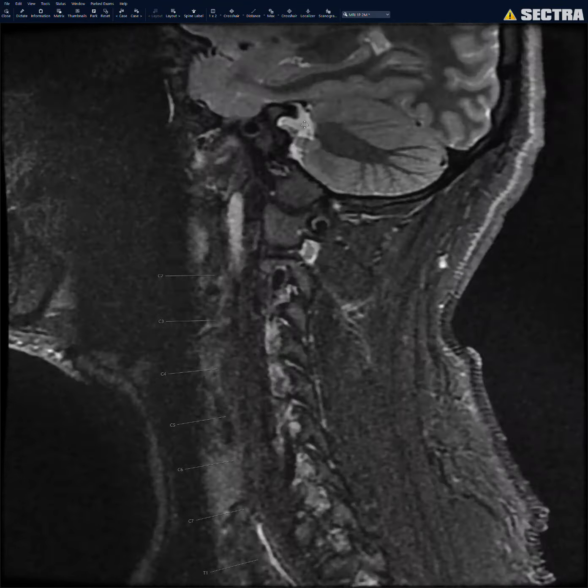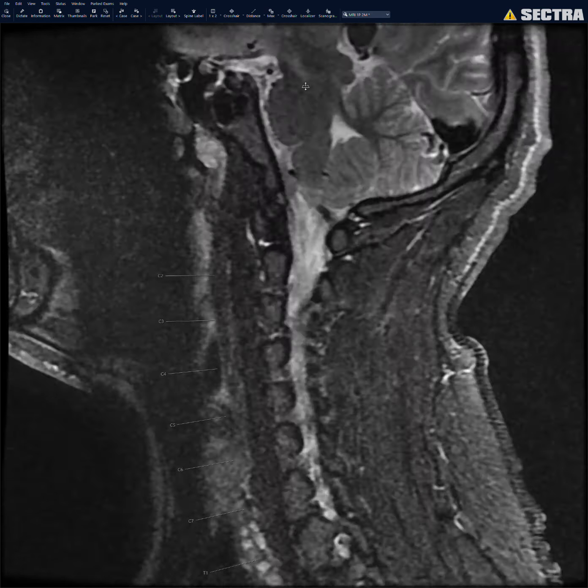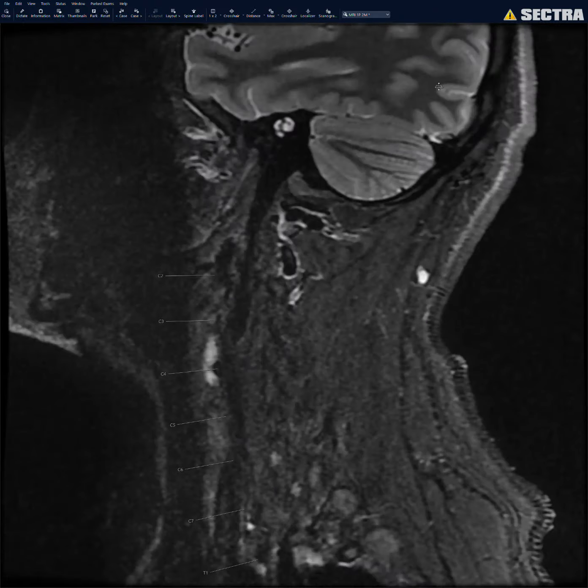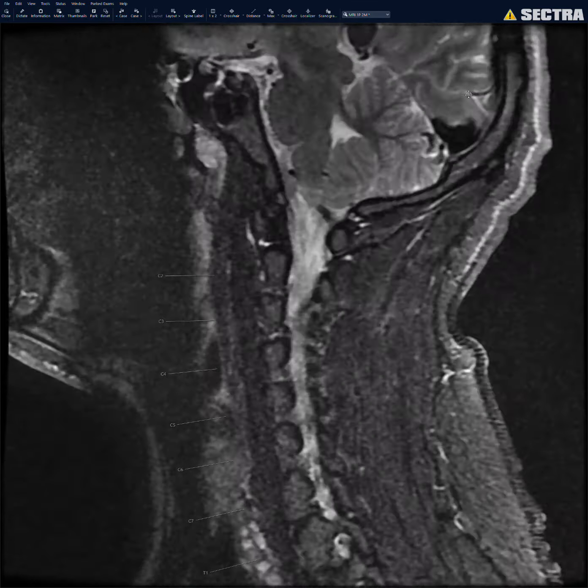And then I always look at the pituitary gland, the sella. Make sure I don't miss a mass in this region, in the sellar and suprasellar region. And finally, I see what I can of the brain parenchyma. I can see part of the temporal lobes on both sides and the occipital lobes on both sides. Make sure I don't miss an infarct or any kind of mass.